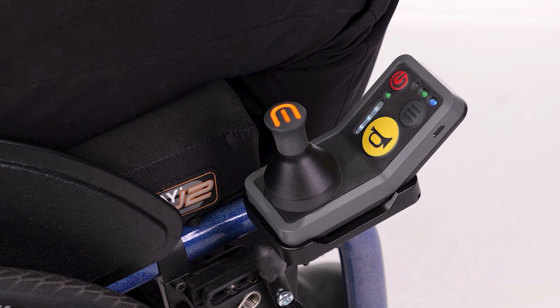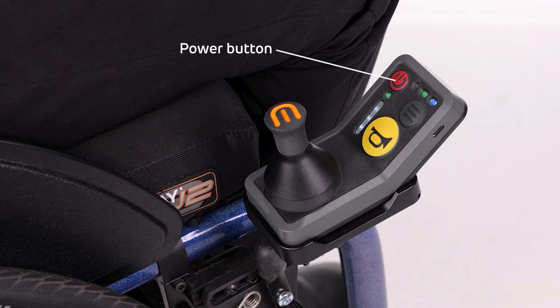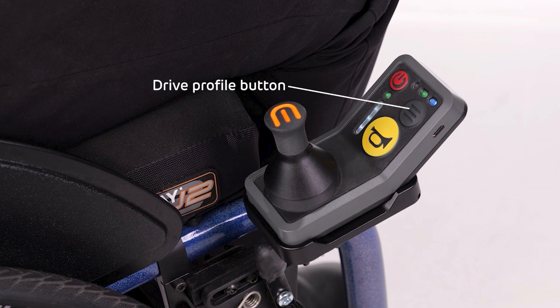First, we need to get familiar with the M90 controller. This light bar here displays the M90 wheel battery. This LED here displays the controller battery. This is the power button. This light sensor here automatically adjusts the display brightness of the controller. We have the status LED and the drive profile LED, the drive profile button, and the M90 horn.